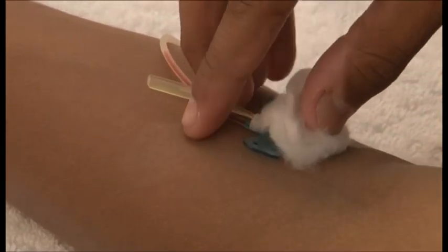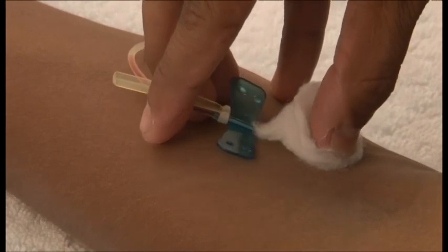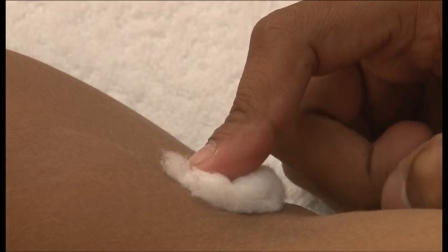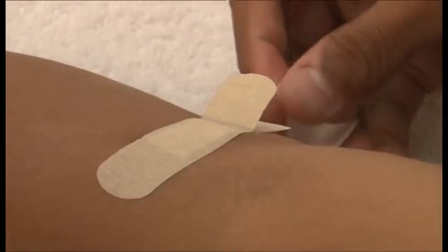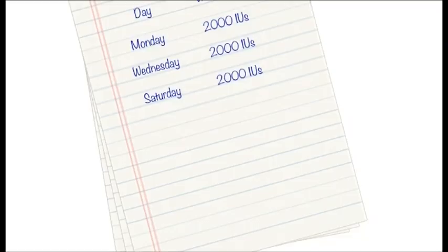Remove the butterfly needle and put a dry cotton swab on the injection site at the same time. Press for about 2 minutes without bending the arm and put on the adhesive bandage. Clean the adjacent areas and hands using the disinfectant liquid. Note down the date of injection and amount of factor injected.